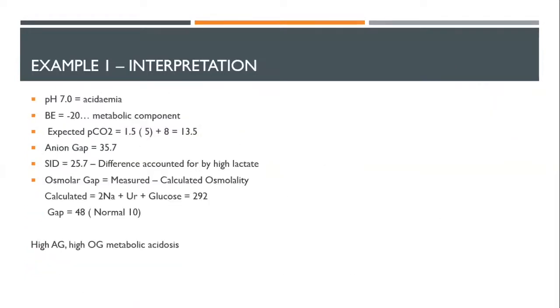And often the lactate analyzer misreads the organic alcohols as lactate. So it's very important to read the clinical scenario, to think about the patient that you're dealing with when you're interpreting your ABGs, and to use any little clues that you have to try and help make a diagnosis.